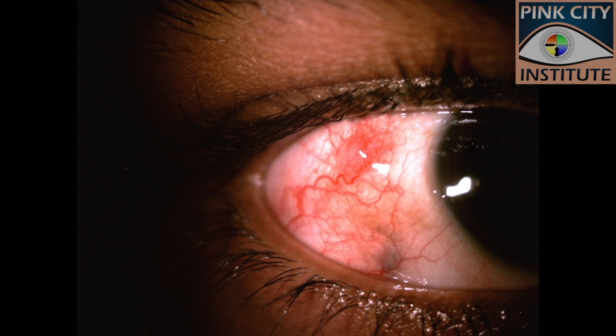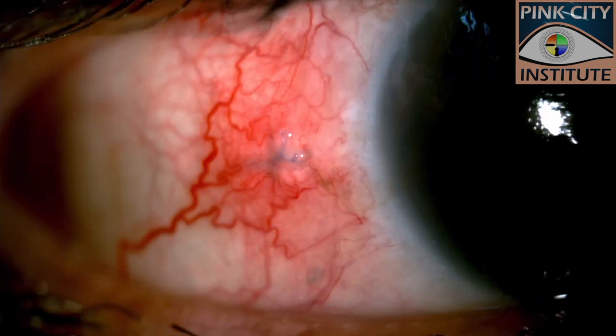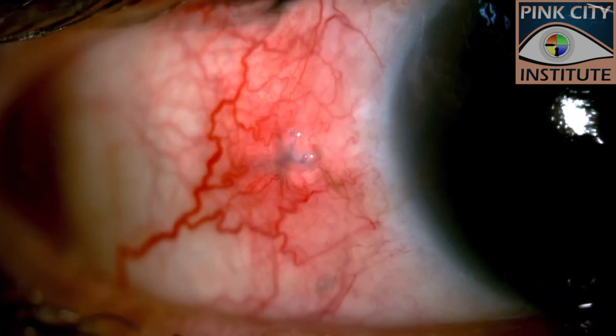Minimally invasive vitreo surgery has reduced our need for sutures. However, suture-related problems like localized inflammation, thinning, foreign body sensation, and discomfort to the patient can still arise and frustrate both the doctor and the patient.